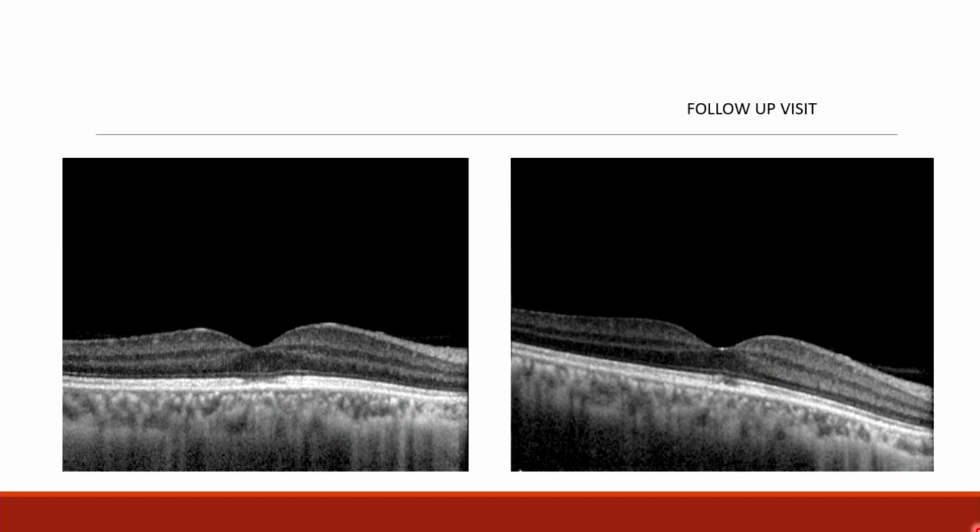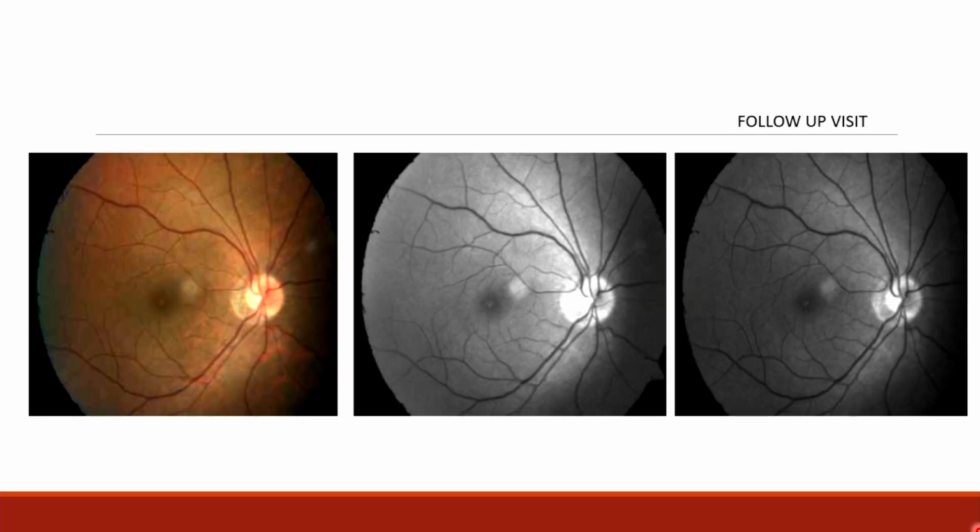and the ellipsoid zone and the interdigitation zone were also coming to normal. But still some defect was present. In the follow-up visit, a certain area of depigmentation was still left in all the images seen, not completely restored.